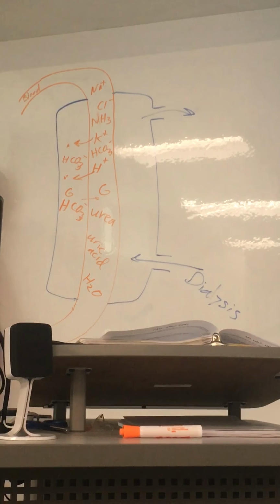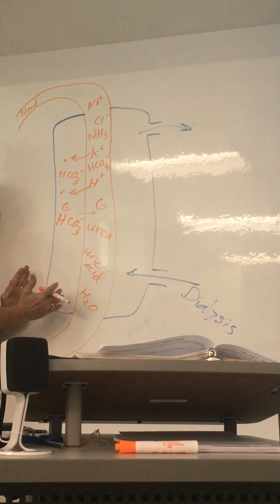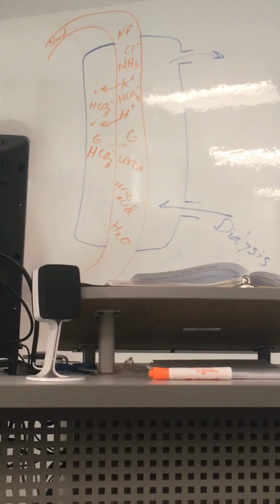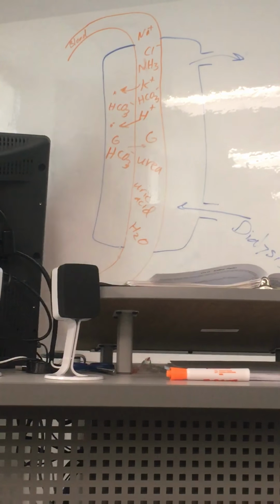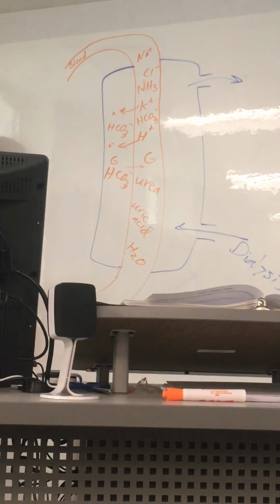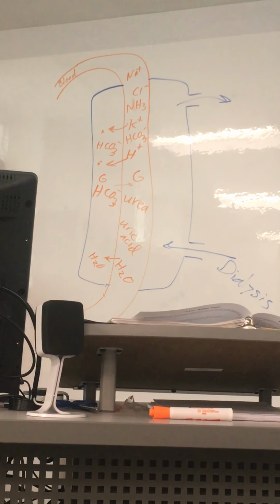And that's it. You can do that for anything on here you want to, including water. You can adjust the concentration of your dialysis fluid to be what you want the blood to be. And you can either suck water out of the blood, which is what you usually need to do. Someone with kidney failure typically has excess water on their body, and it's not uncommon for them to go in to their session, like this young man, and then come out 20 pounds lighter. Literally lose 20 pounds of weight just by sucking the water off of the blood and into the dialysis fluid.